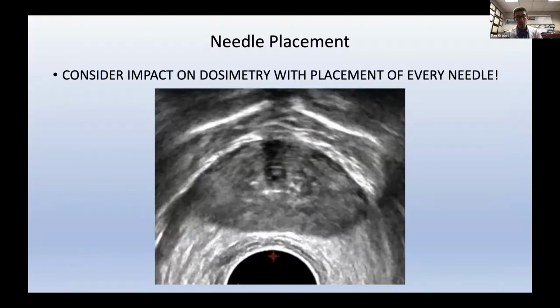So when you're placing your needles, here's just the typical wide axial slice of a prostate. I'm going to sort of walk you through. I tend to use more needles, I would say, than the average practitioner. I like having the options. I tend to do implants that are a little more on the homogeneous side. When I'm placing my needles, I always start with the anterior 2 needles. I try to keep these as close together as I can on either side of the urethra. So you track the urethra from base to apex, make sure your needles aren't going through.